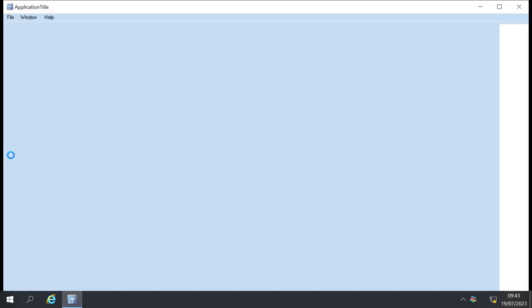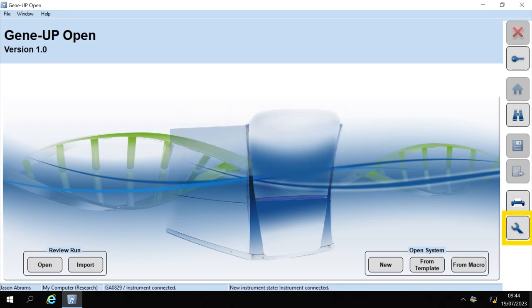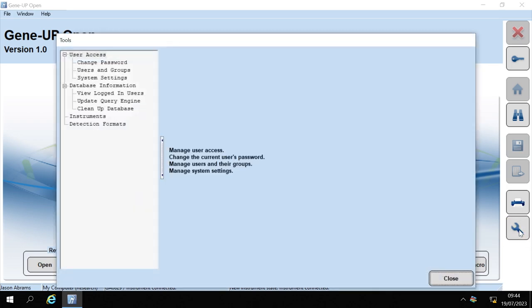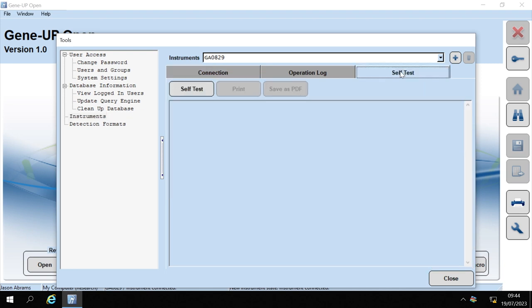After opening the open software, log in and click on the Tools button, the wrench, located on the global toolbar on the right-hand side of the screen. The Tools window will open. On the left-hand side of the screen, select the Instrument tab. Make sure that the software is connected to the instrument. Select the Self-Test tab. Select the Self-Test button.